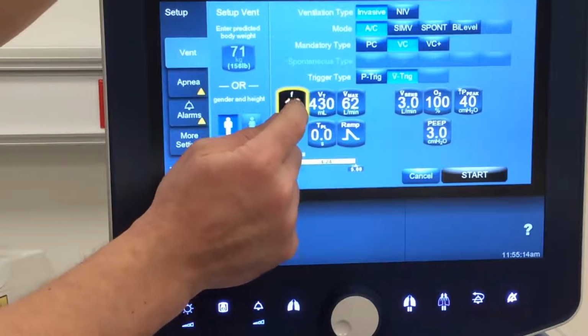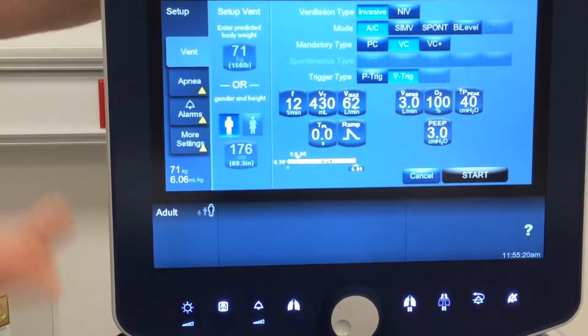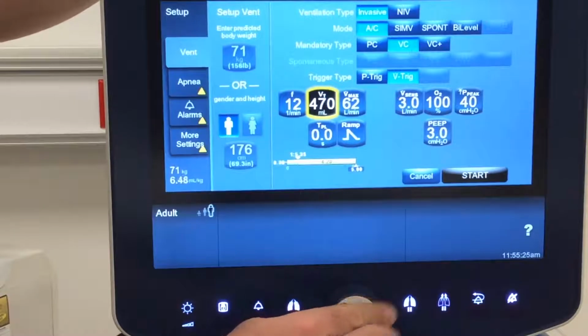So I'm going to go with a respiratory rate of 12. Once again, I'm going to give you this handout and you can follow along. Our settings we're trying to go for are volume assist control, a respiratory rate of 12, a tidal volume of 550 milliliters.